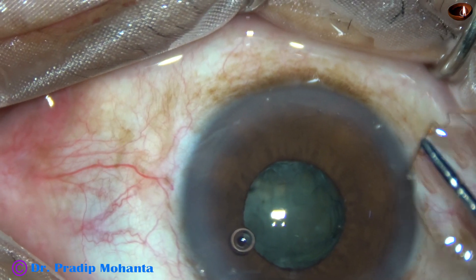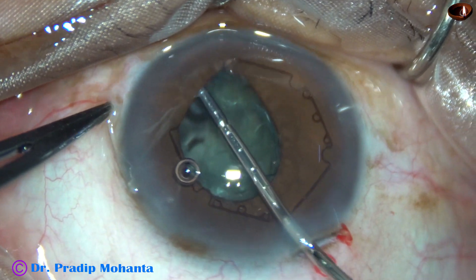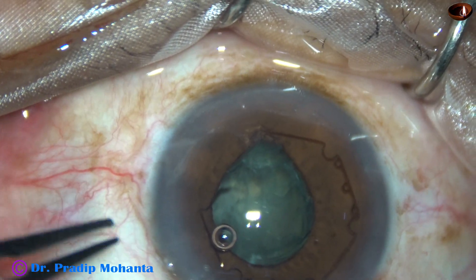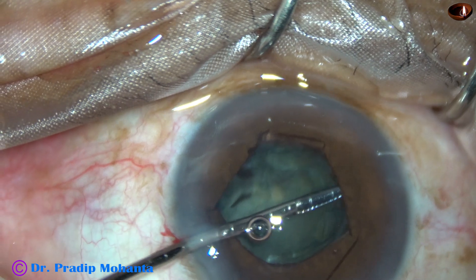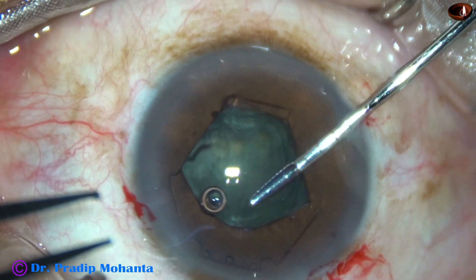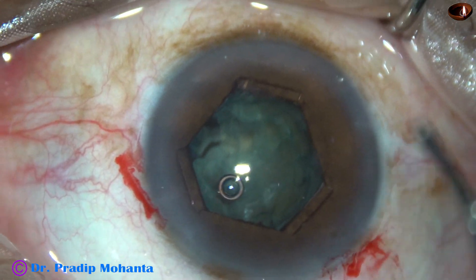I am going to use this hexagonal pupil expansion device invented by Dr. Subhan Bhattacharji of Kolkata, India. This device is uniplanar and very thin — it can be used in very shallow anterior chambers. Here it goes: the leading flange is tucked under the iris. Now I am going to tuck the flange at 10 o'clock. There are notches and flanges, and alternate flanges are tucked under the iris. After tucking three flanges, the pupil takes this hexagonal shape — size is about 5.5 mm.